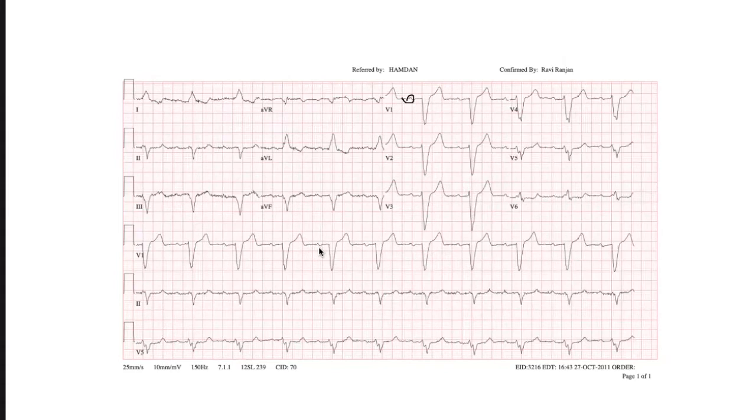Lindsay, will you do QRSs? Not sure if it would continue past there and go into that next. So that next part is going to be the T wave. Okay. Well, I just told you where the T wave is, so we don't need to go over that. So is this a left bundle branch block or right bundle branch block?